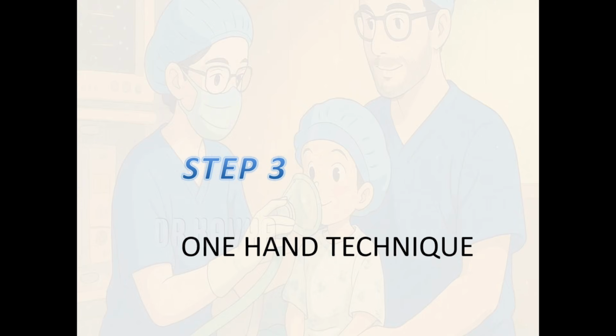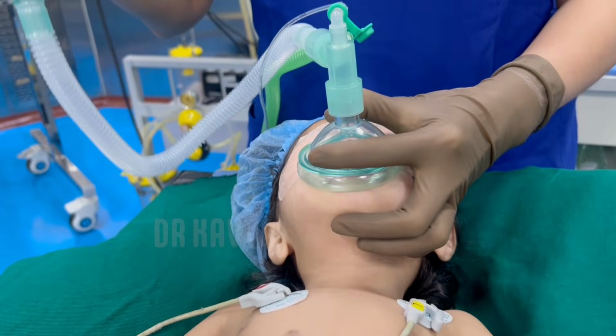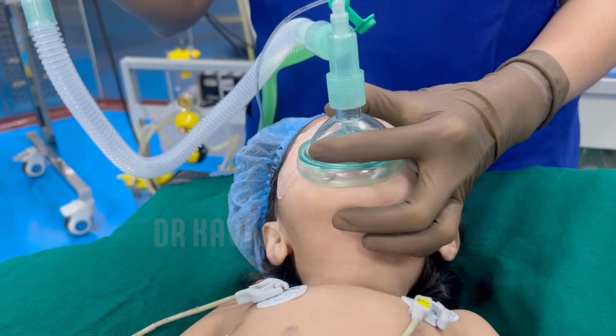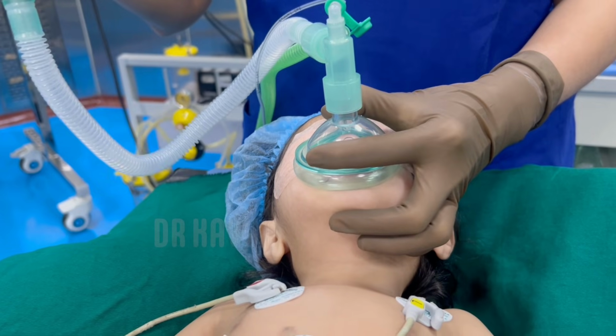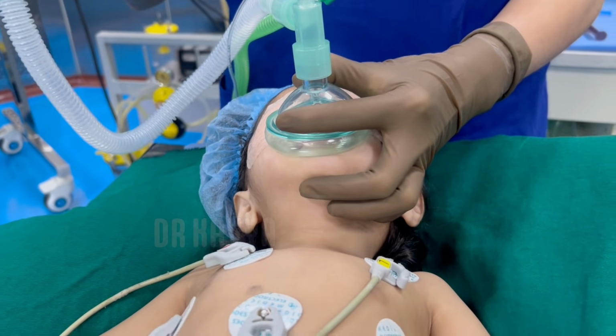Step 3. One hand technique of mask ventilation. A tight seal is achieved with the C and E technique. The thumb and index finger of one hand form a C over the mask and are used to control the seal of the face mask, while the other three fingers form an E under the jaw to lift it forwards.